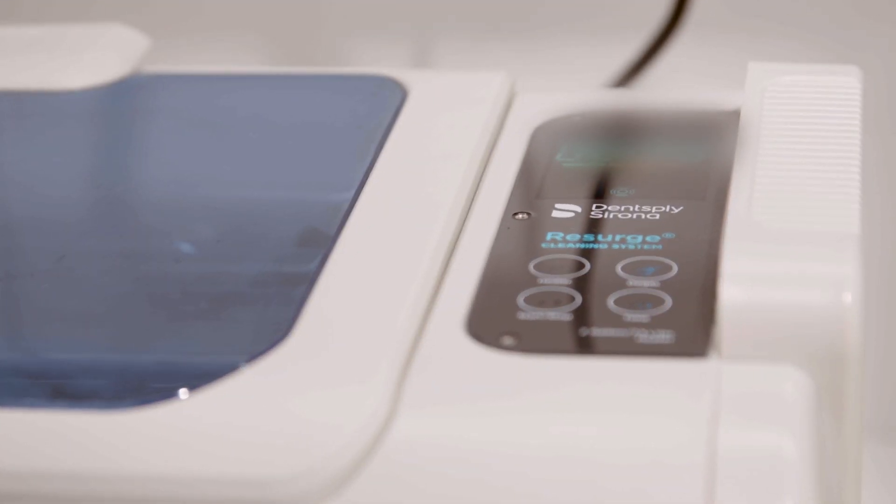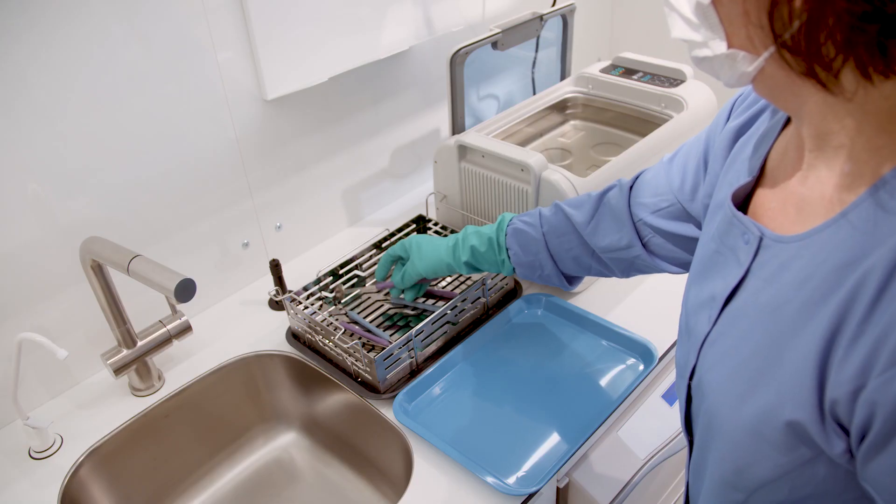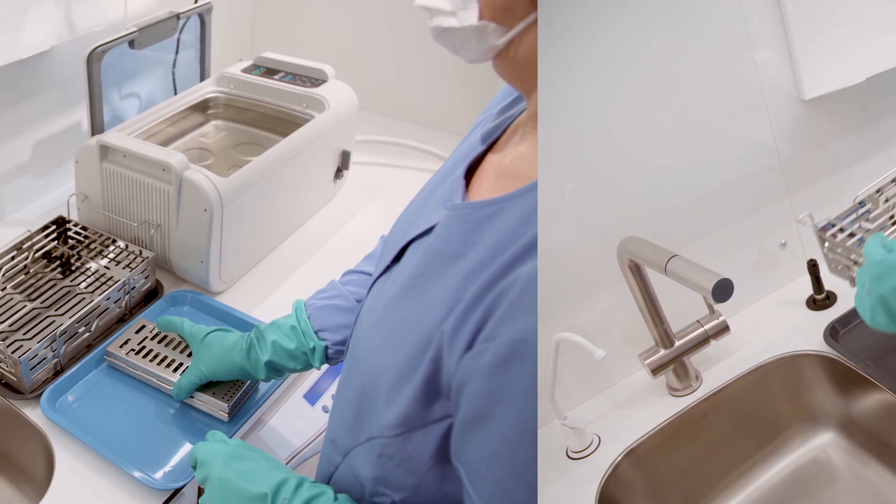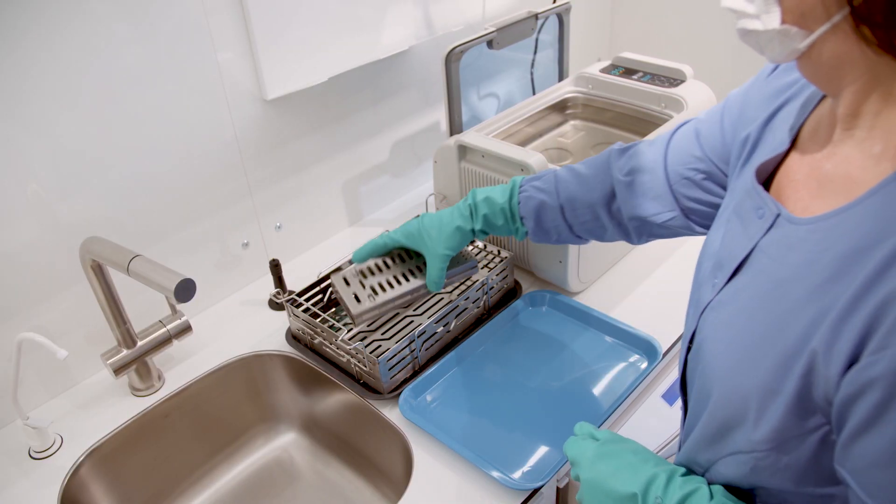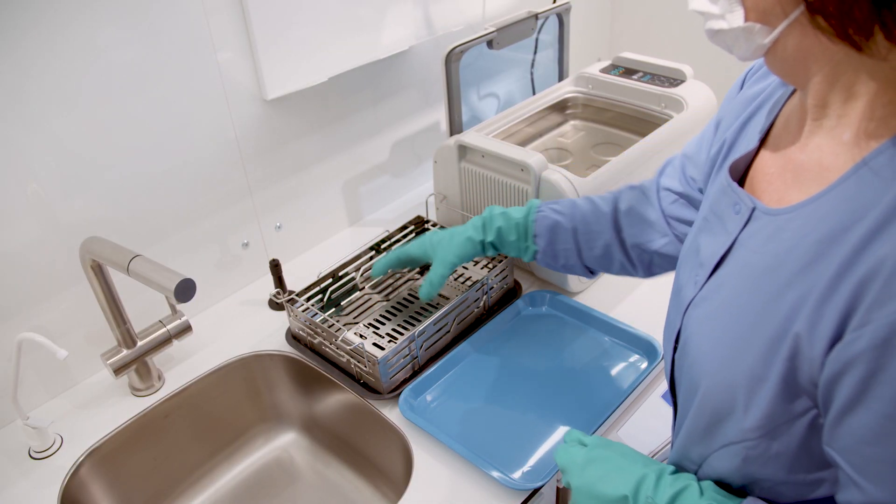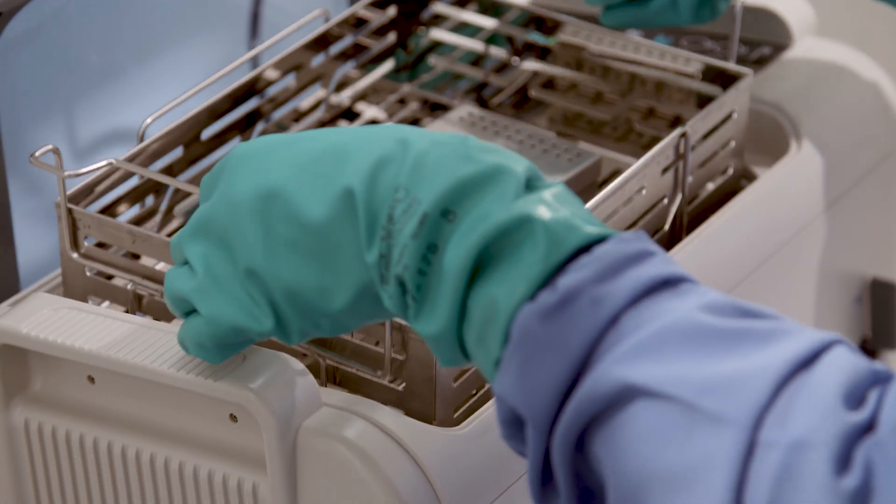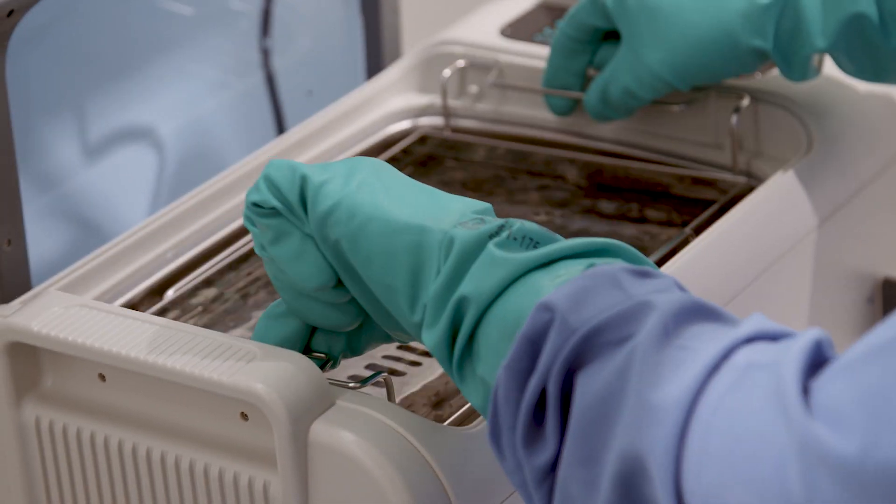Once the degas function completes, remove the lid and place loose instruments into the basket or stackable trays in a single layer. If using cassettes, place them directly into the universal rack. Lower the universal rack containing the basket, stackable trays or cassettes into the bath and close the lid.